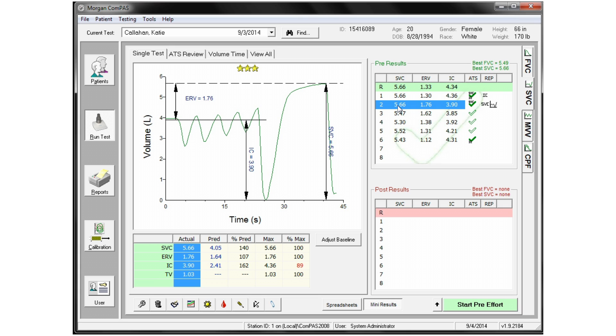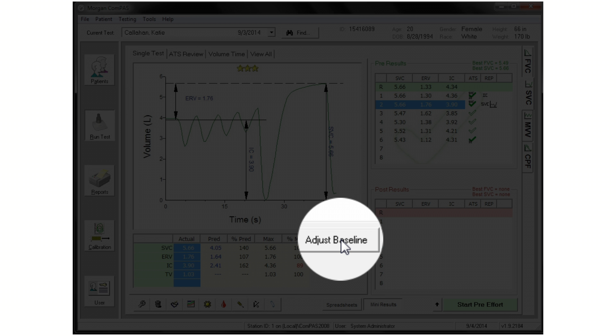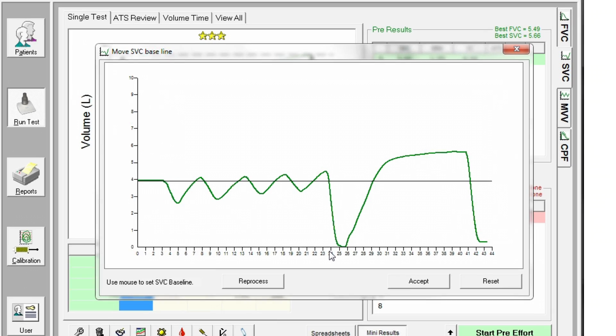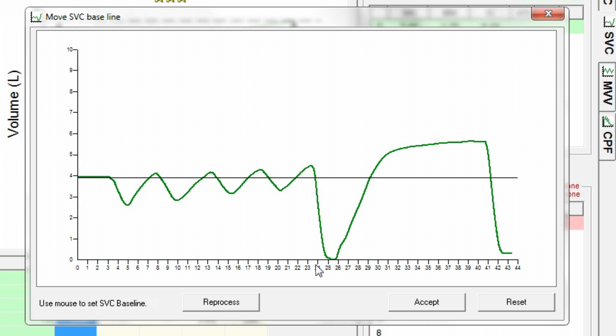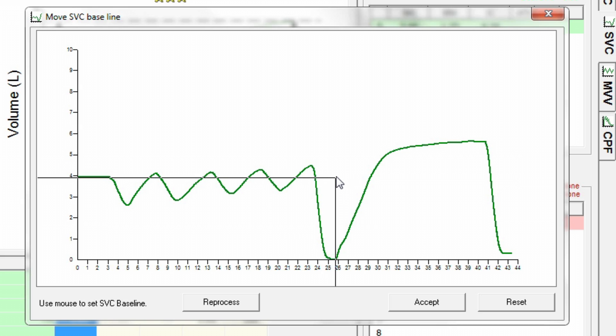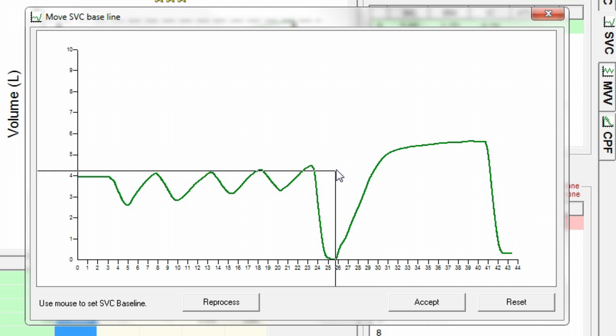If you want to change the position of the baseline, click on the Adjust button on the Mini Results screen or alternatively right-click on the SVC graphic. To move the baseline to your preferred position, simply left-click on the screen and drag the moving baseline to the new location. Once you let go of the mouse, the line will be drawn.